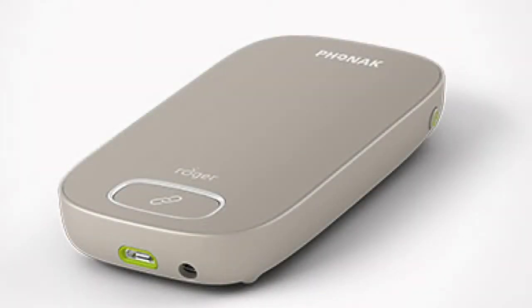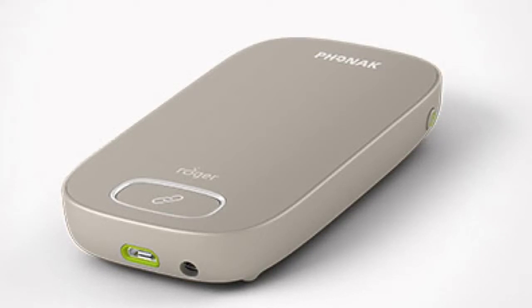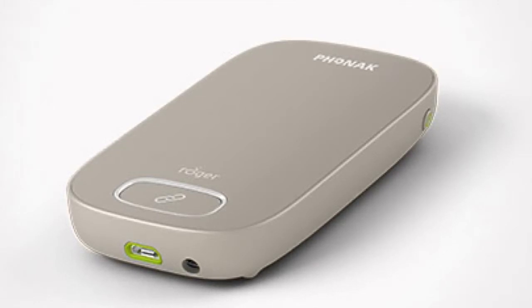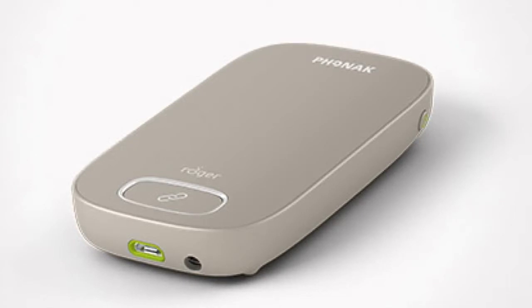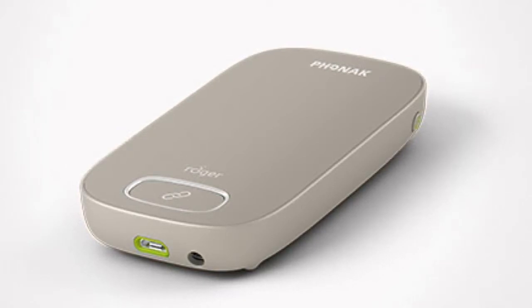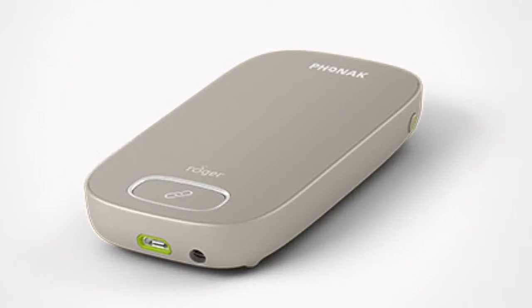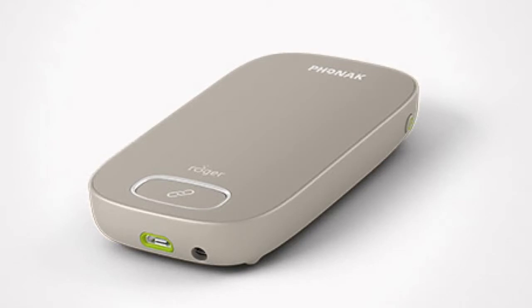The Multimedia Hub is used to connect the Roger touchscreen microphone to other audio sources used in a meeting room or classroom, such as audio from a computer when watching a video, an MP3 player, or an interactive whiteboard. It can be used with the Soundfield system to amplify the audio for everyone, or can be used by an individual student. The Roger Multimedia Hub will transmit the audio sound simultaneously with the sound from the Roger touchscreen mic, so both the teacher and the audio source can be heard at the same time.